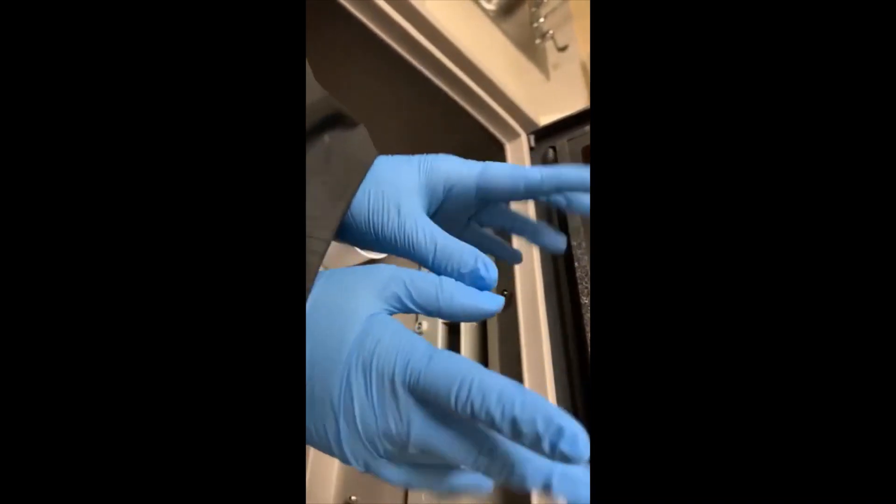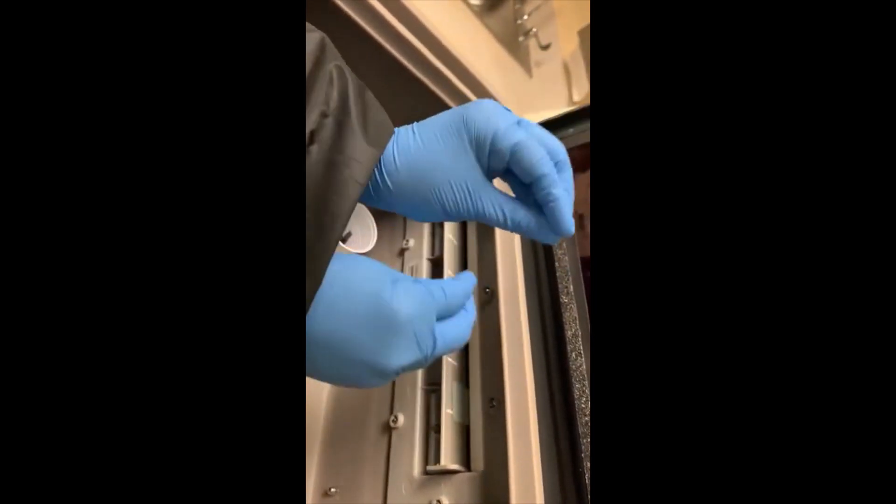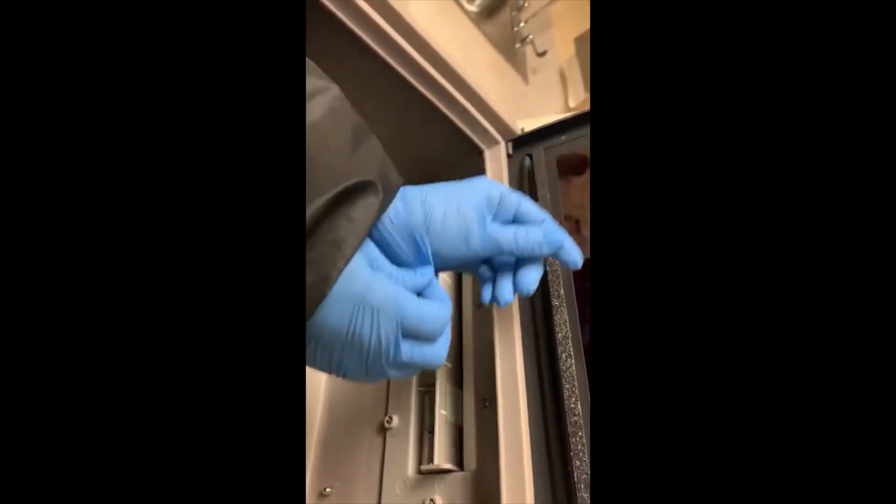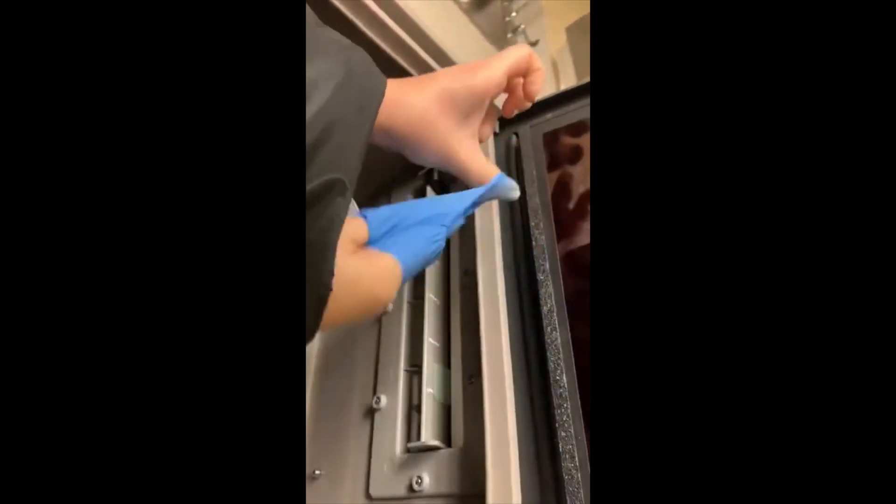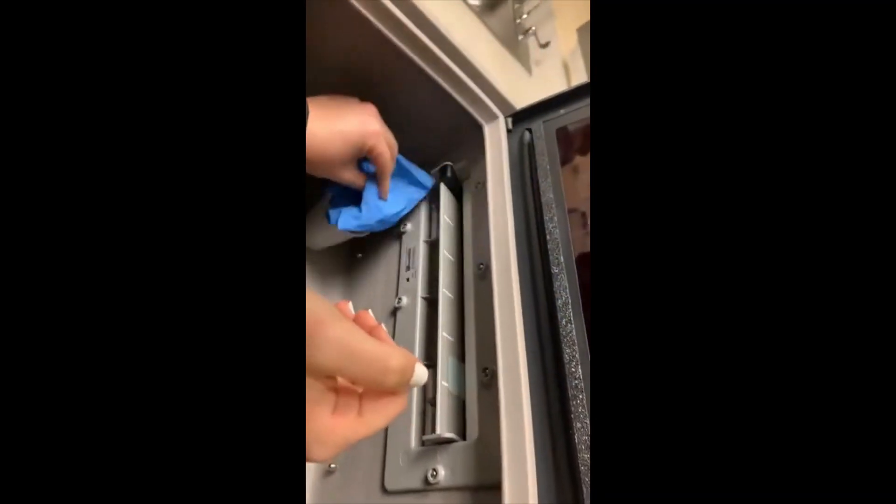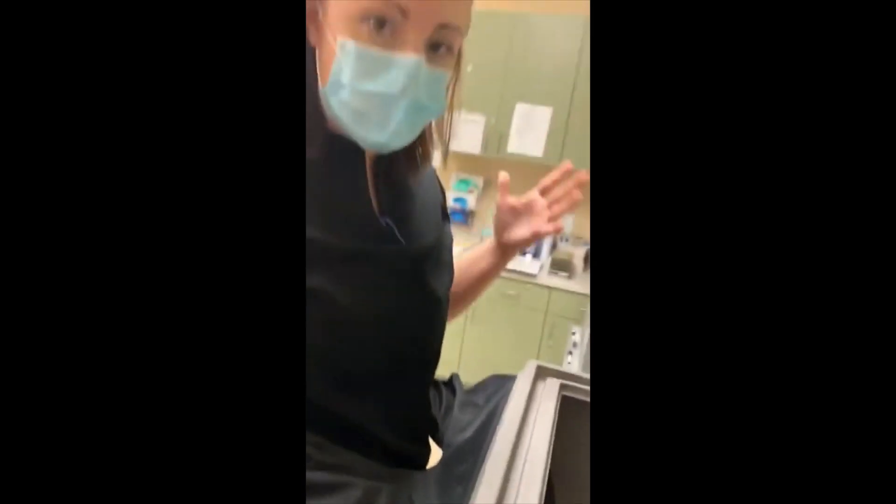Because your gloves would be technically considered contaminated at this point since you were touching film, you're going to take your gloves off inside the daylight loader. You're going to take those gloves, stick them in your cup, and then pull your hands out the sleeves. Then you're done.